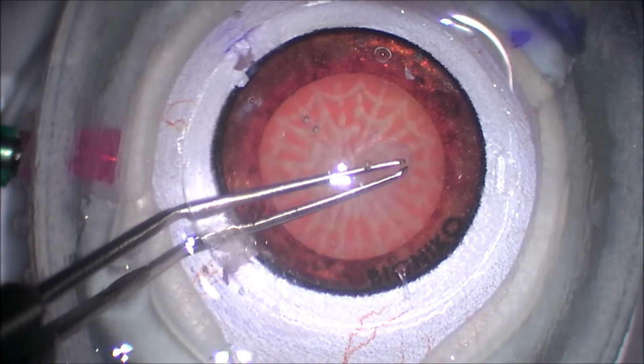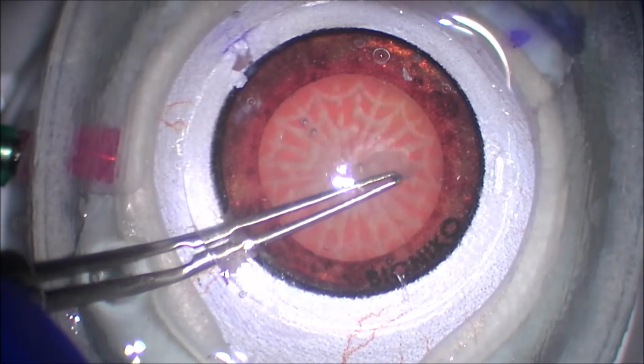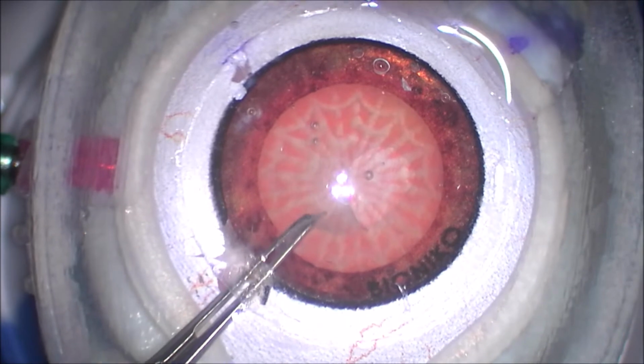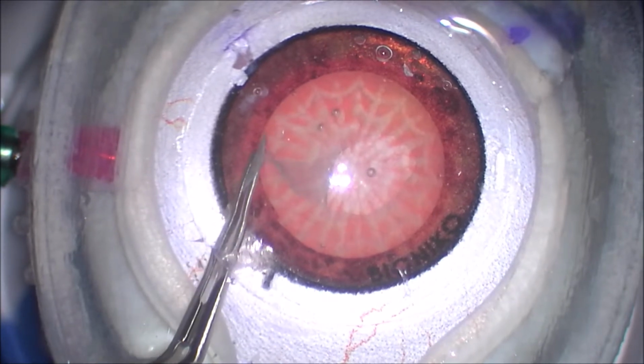And so again, she's left-handed, as you can see. She's doing the best she can to try to grab that flap. She finally got it. And now she's, again, directing her forces down towards the incision. And she's going to have to try to make that turn. She's turning her hand a little bit. She's supinating a little bit. And then she's getting it around. Rexis a little bit on the small side, but not too bad.